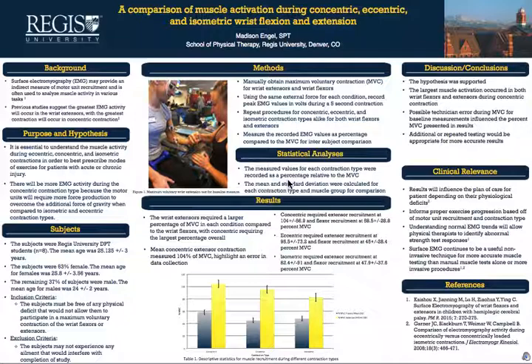Clinically, this information is extremely useful as it will guide physical therapists to creating a plan of care for their patients. It will also help PTs recognize potential abnormal muscle activity. This could help us uncover potentially a different ailment or potentially a comorbidity that may exist within a certain population that we are working with.